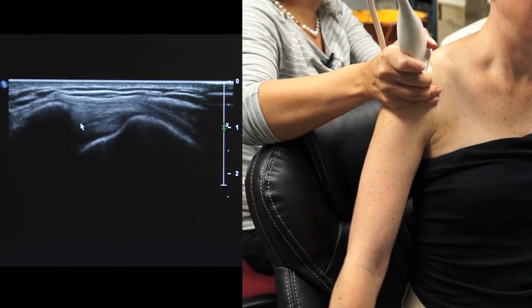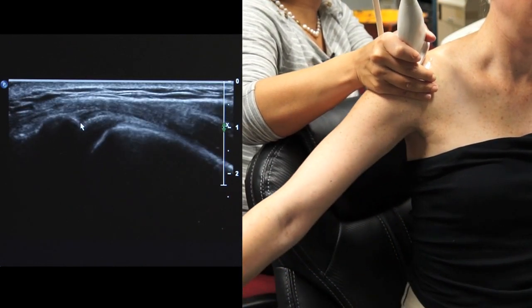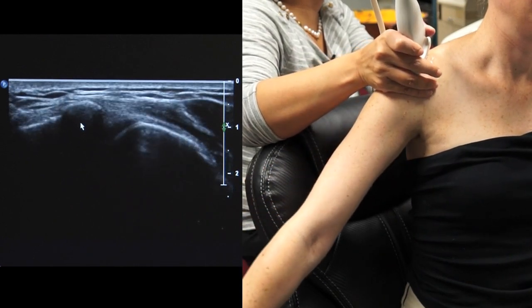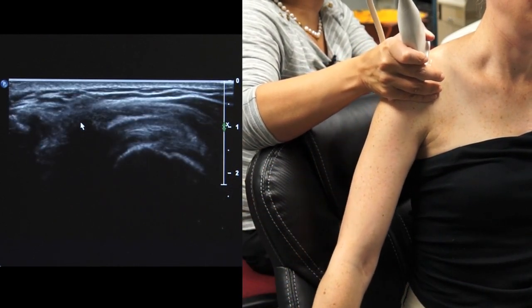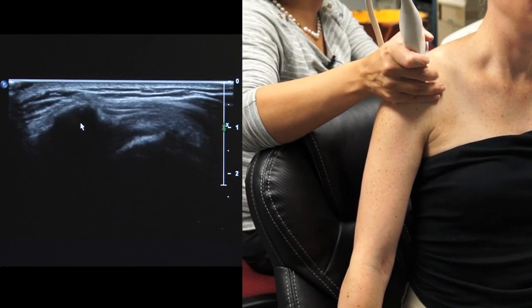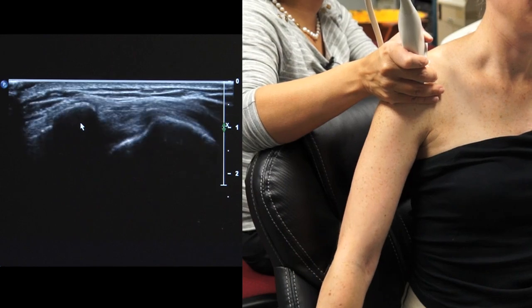Let's just raise it a few more times. Here again, we see it completely going under the acromion. Okay, and go back out. And there we see it again sliding out from underneath the acromion. Okay, so this is how we would check for impingement.